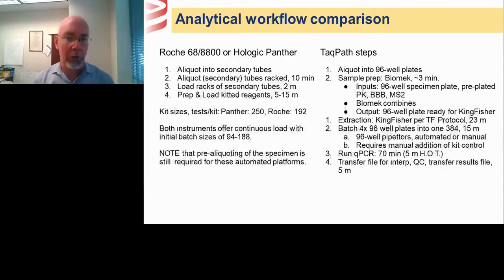the automated platforms. But at the same time, if you were to look at throughput or even throughput per FTE, it's quite a high throughput platform. We're able to produce a large number of results. And again, unlike the automated platforms, the ability to add incremental capacity is much more straightforward, especially once you have a trained workforce and your procedures and process and environment are set up appropriate to the testing.